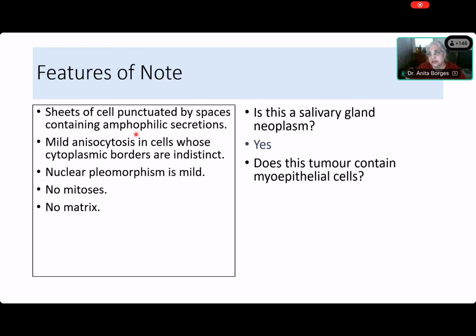Tell me. In adenoid cystic, they are looking basaloid looking cells. Very good. And in pleomorphic adenoma? In pleomorphic adenoma, what we have seen is spindle like cells. No, we didn't see spindle cells at all. We saw some basaloid cells. We saw some cells with oval or small nuclei, hardly any cytoplasm. Yes, that's what we saw.